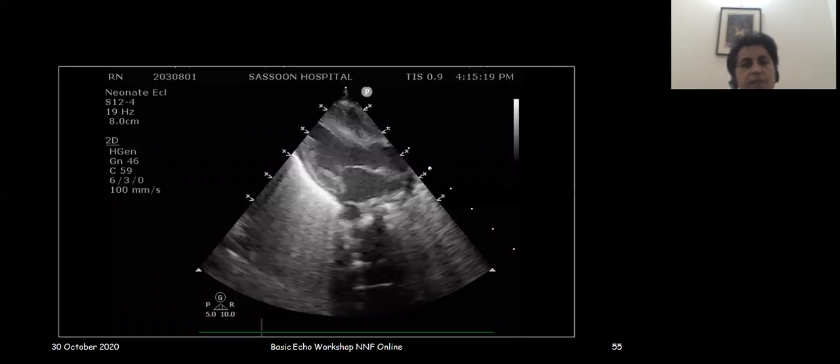Now here is an image that I'm showing you. What I wanted you to see is, look at all the V's on each side. These are the focuses. The focus is seen as an inverted V image. So here in this image, I have 5 focal points. If I were to reduce it to 1 or 2 focal points, my image would be better and brighter.